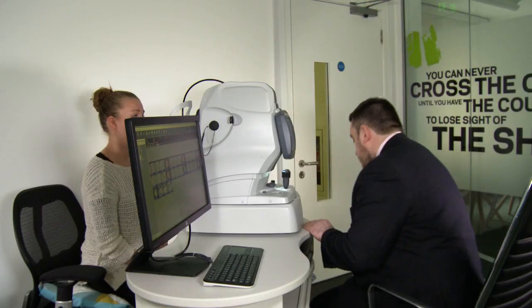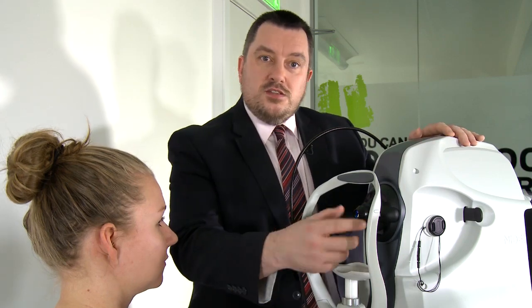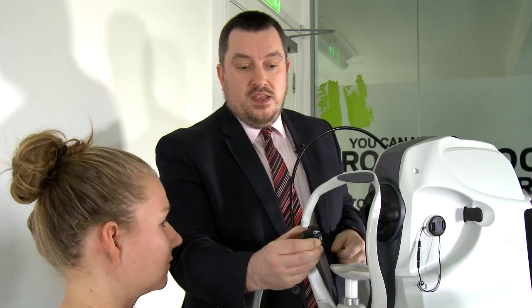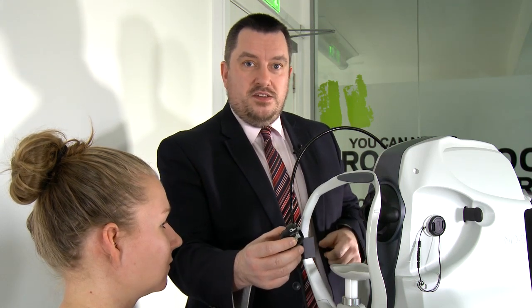So now that we've taken anterior OCT scans, we'll need to remove the anterior lens module to be able to carry on taking other scans, so we'll do that now. So again, we grab the calipers, push them in and pull the lens out, and we need to put it back in the box to store it safely, and we'll do that too.